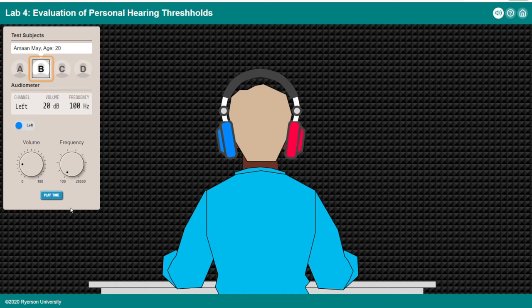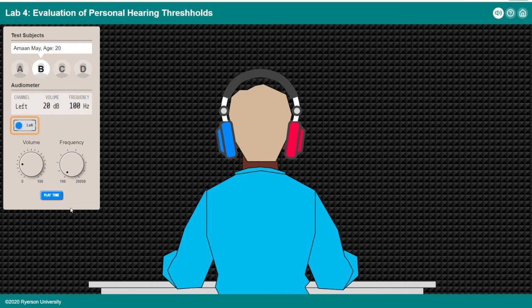Subject B selected: name Aman May, age 20. Subject C, Subject D. Audiometer channel toggle: left channel, right channel — left channel selected. Volume control: use arrow keys to change.